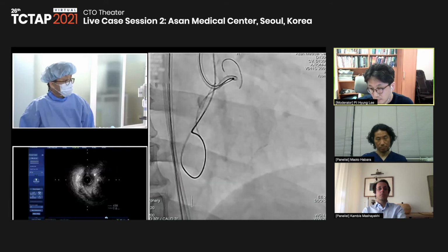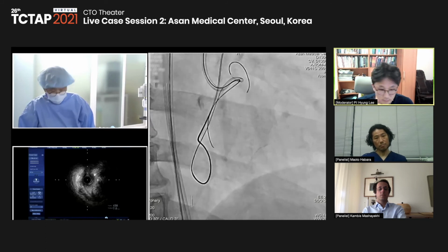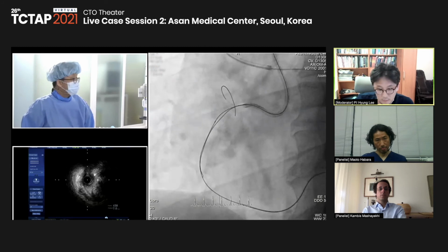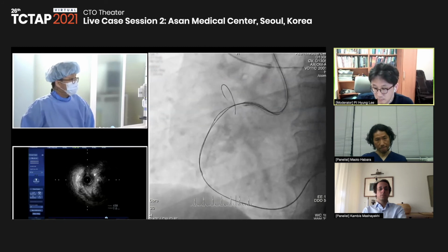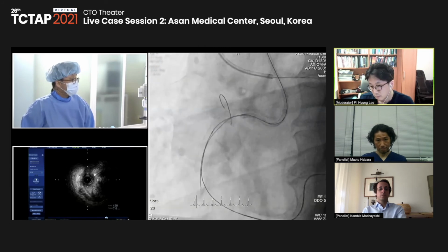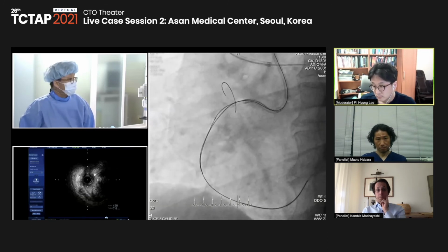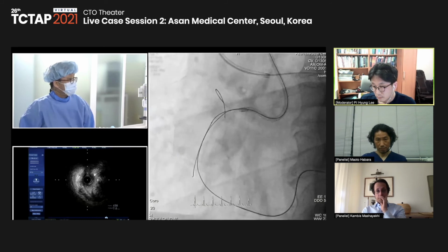So you see that in angio, the wire where the retro and antegrade cross together, that's the point where they meet. And then thereafter, at the proximal, the retrograde wire goes into the true lumen, I think. Of course, the antegrade wire at the proximal is in the subintimal place. This is a 3.0 balloon, and after that, the retrograde wire goes into the guiding catheter, like this. So I succeeded in putting the retrograde wire in the antegrade guiding.